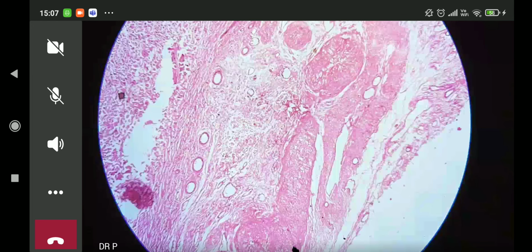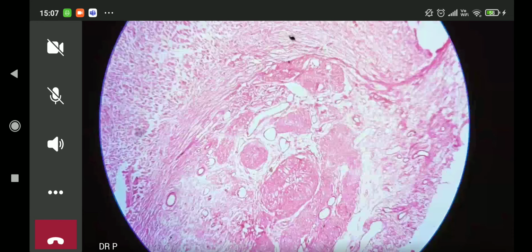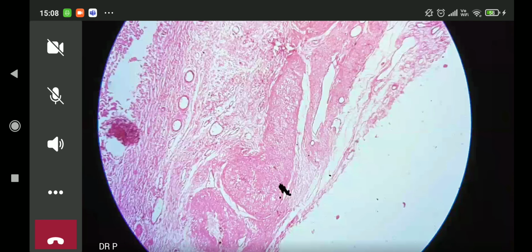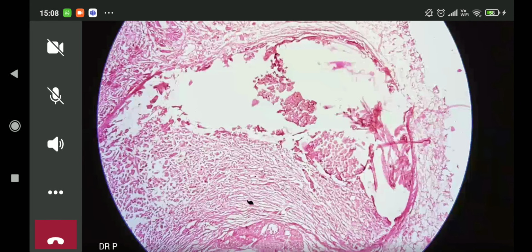So obviously the patient may be elderly, right? And she may be having some hypertension. Okay. She may not even be that elderly, but yeah, she has thickened blood vessels. However, this is a secondary finding. The actual pathology is something else. So look at this. What do you think it is? Any guesses? What do you think this is?